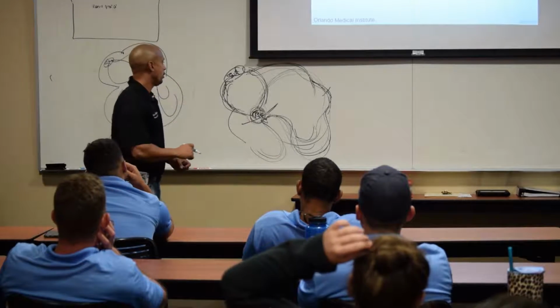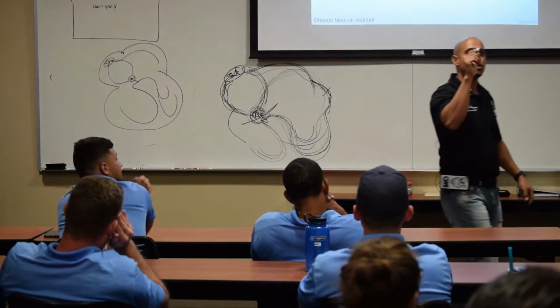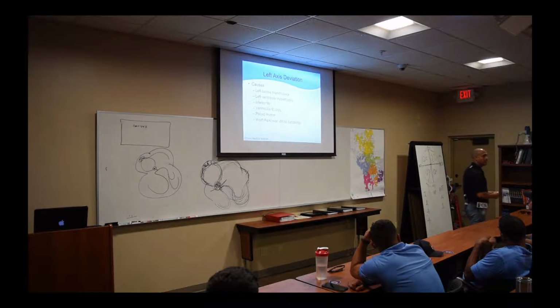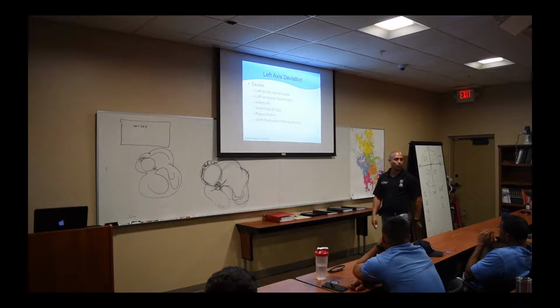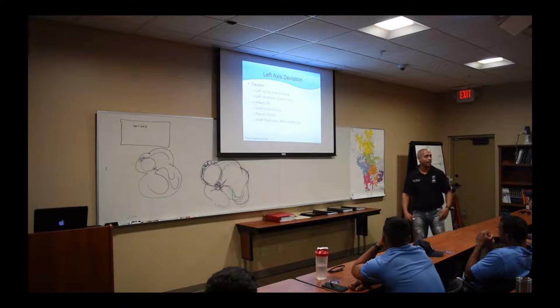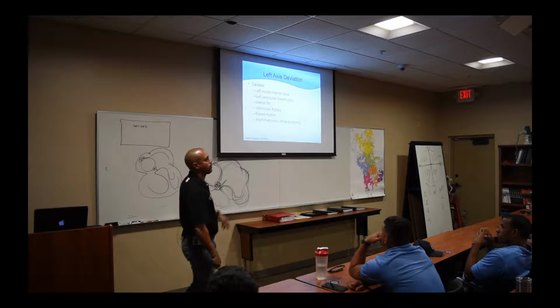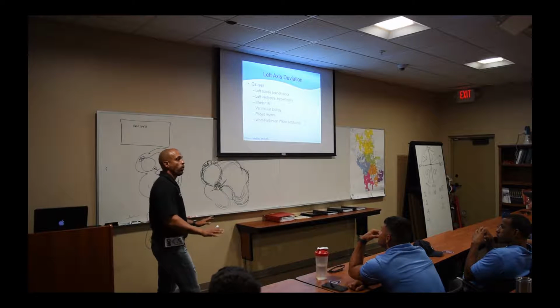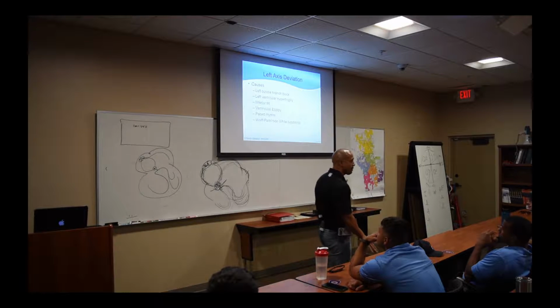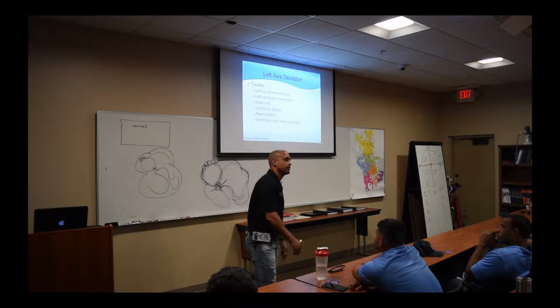You with me? So, if I have the branch on the left side, guess what kind of axis deviation I will have? Anyone guess? Right or left? Left side. If I had the branch on the right side, guess what kind of axis deviation I will have? Right side axis deviation. So by knowing axis deviation, I'm questioning, do we have WPW? I can see exactly where that bundle of Kent is, left versus right. But one thing for certain, what are we not going to give that patient? Calcium channel blockers. You know, but you can do whatever you want on your last day of work.